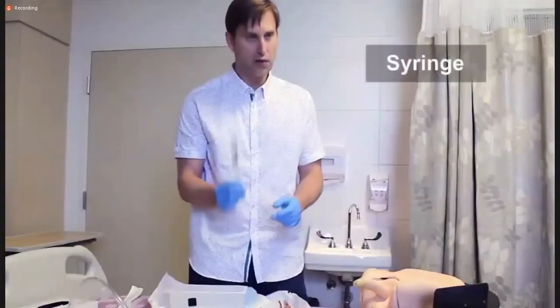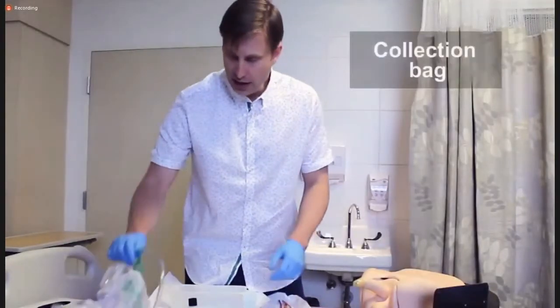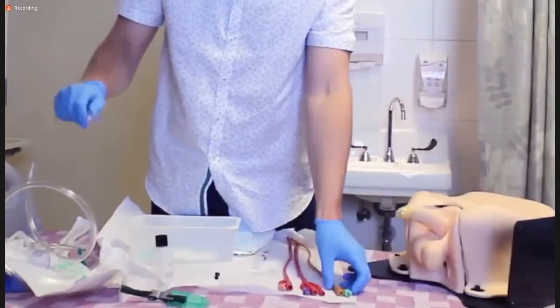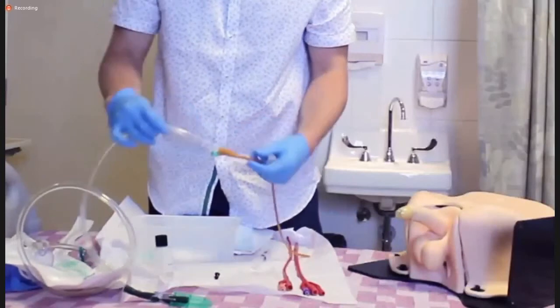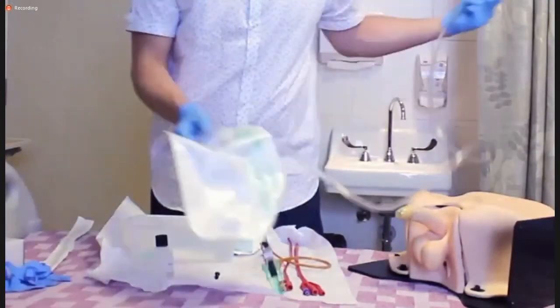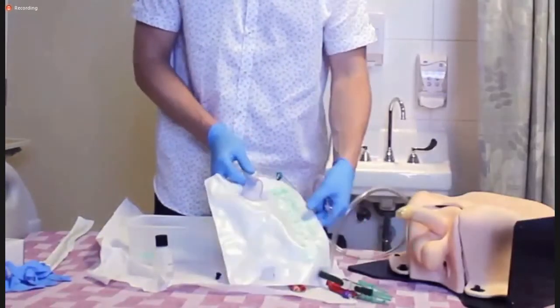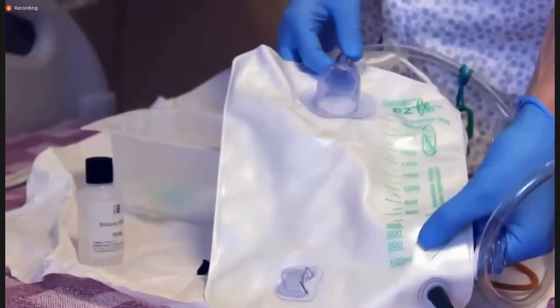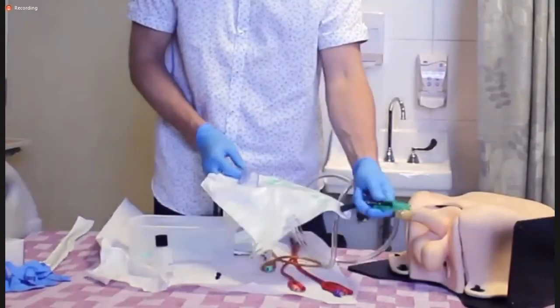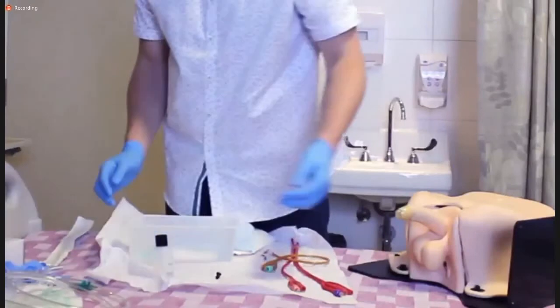You'll need a syringe to inflate the balloon with water, and you'll also need, at the very end, a collection bag. And this collection bag is essentially a tube that will hook up to the drainage port of your catheter that will collect the urine. This catheter bag then usually has measurements on the side. In this case, it's not very accurate gradients, but will tell you in general terms how much urine the patient is making. And then, of course, at the very end, there's a little lever for releasing that and emptying it. So that's your basic equipment.